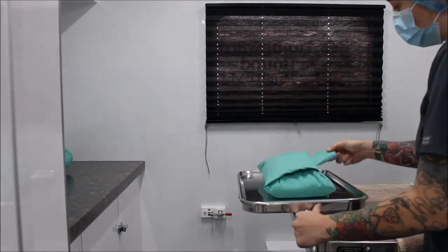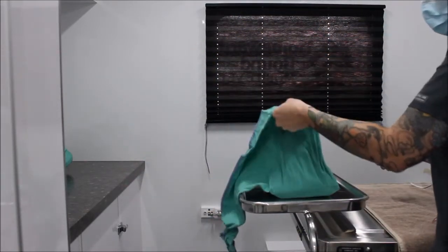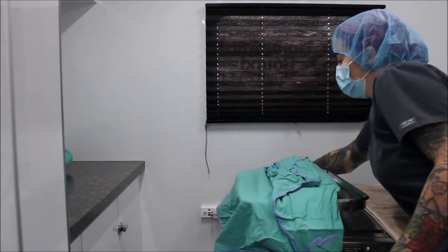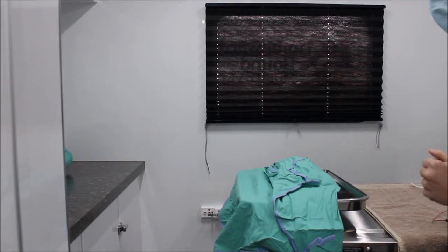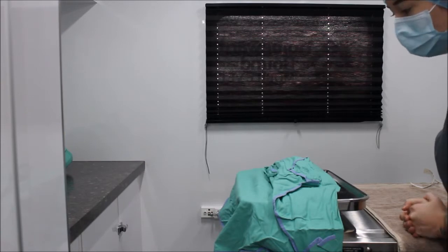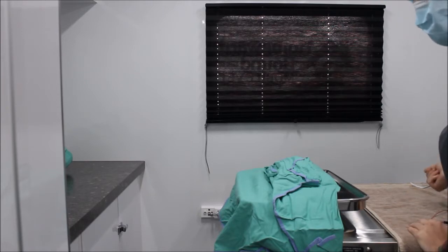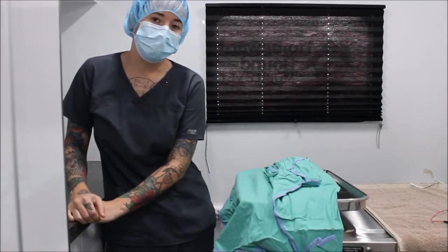I'm going to open just three flaps. First we open the first flap away, then that one, and that one. Now I'm going to leave this last flap without touching it, so that after I am gloved and ready to help perform surgery, I will be sterile and able to open this pack. Now I'm going to get gowned up and gloved up and ready for surgery.